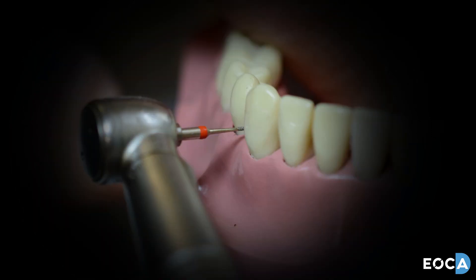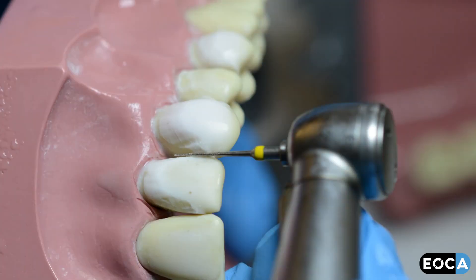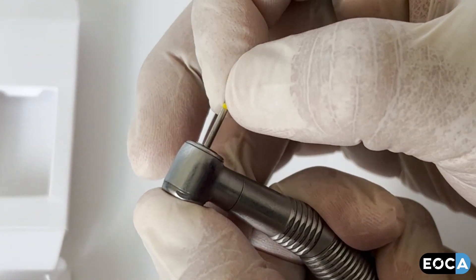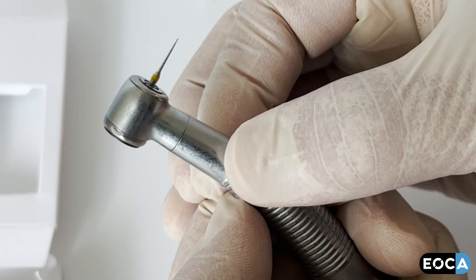Once overhangs are removed, polish with the red and then the yellow-band diamonds. Remember to handle with care and place the burr into the high-speed handpiece with fingers or tweezers.